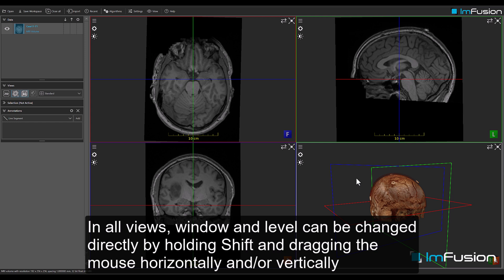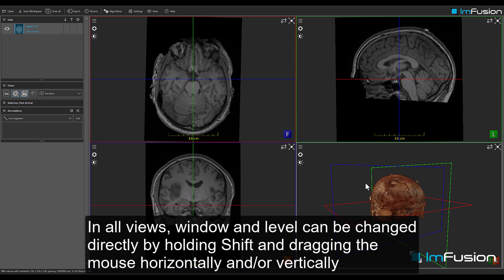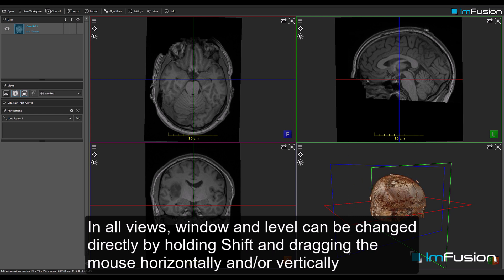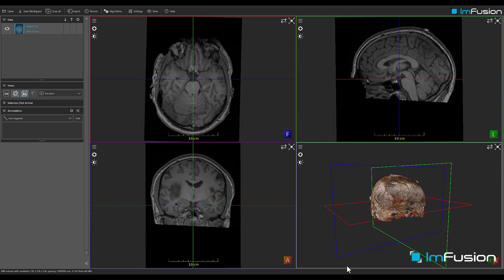In all views, window and level can be changed directly by holding Shift and dragging the mouse horizontally and/or vertically.